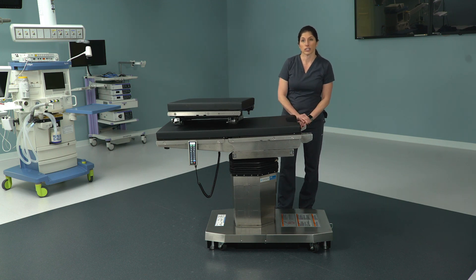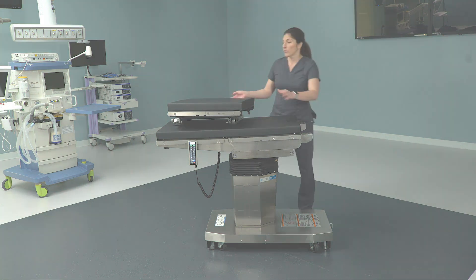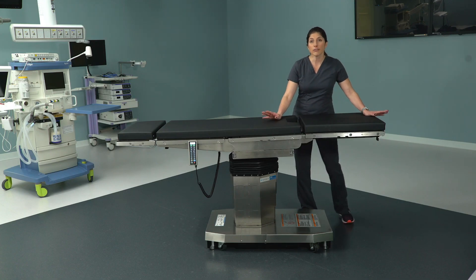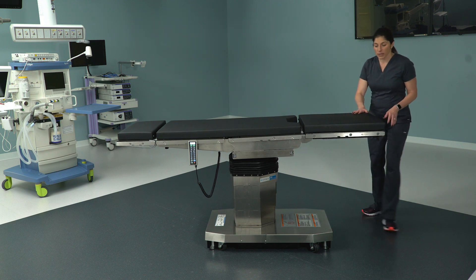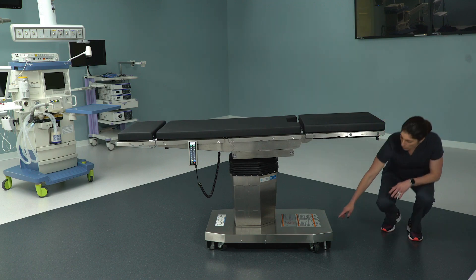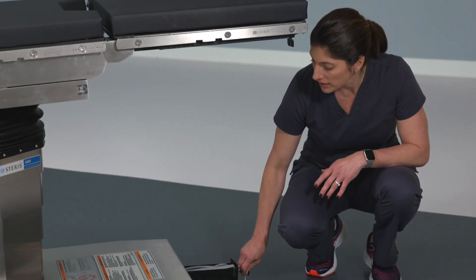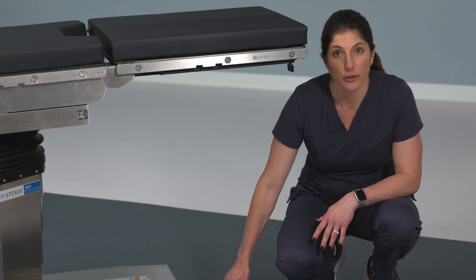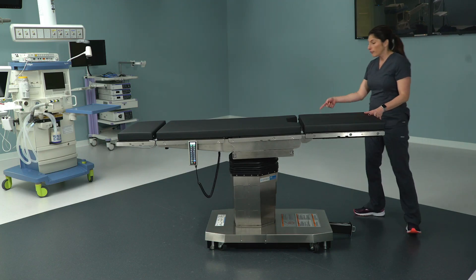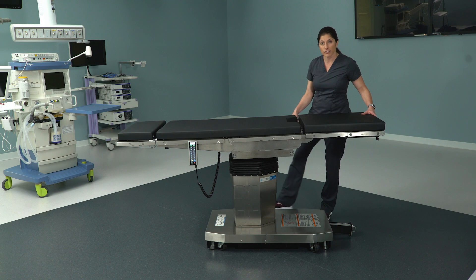And you've got access to the patient in stirrups. The final thing I want to point out about the 5085 is the backup controls. Just like the 3085, the 5085 has backup in case something were to happen to your primary hand control. The difference is the method — the 5085 has a drawer at the base foot end of the bed. Pull this drawer out and you'll see there is a secondary hand control in there for your use.